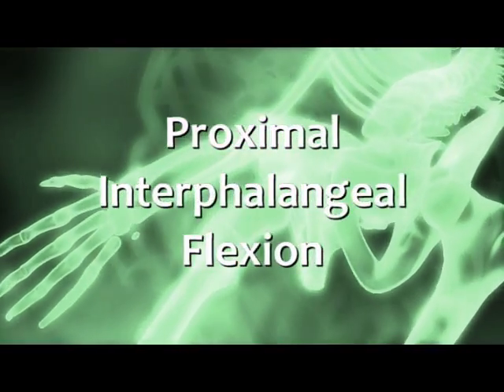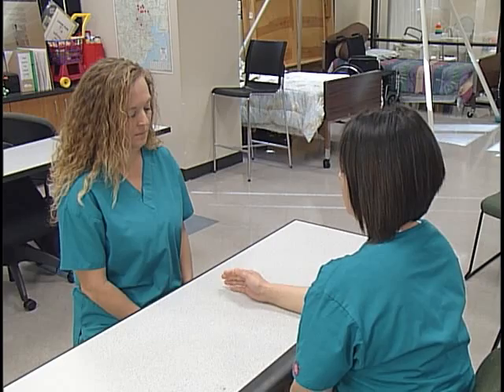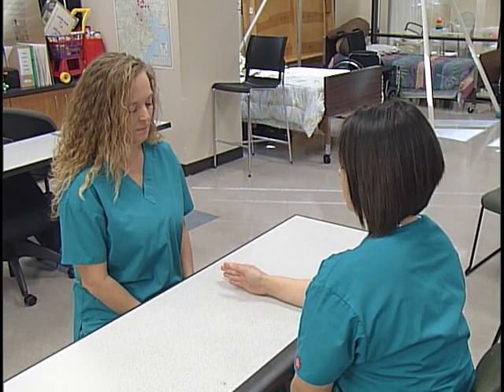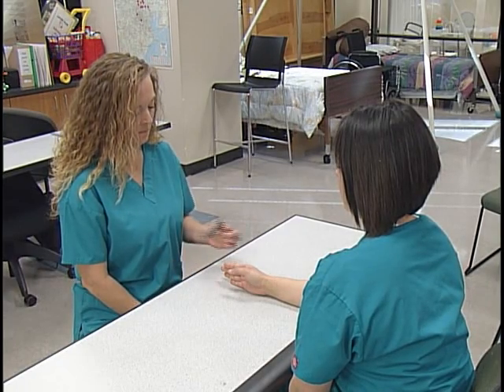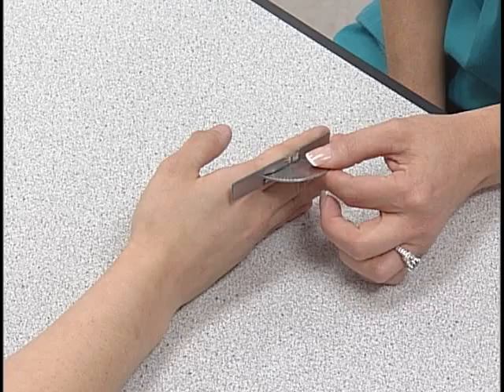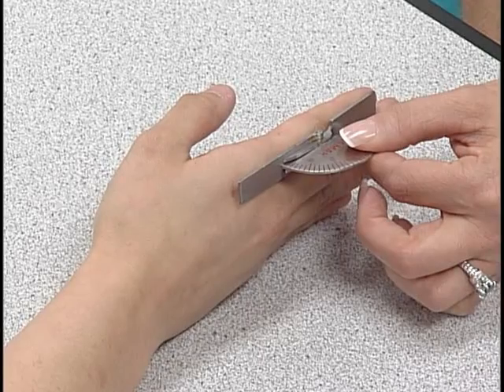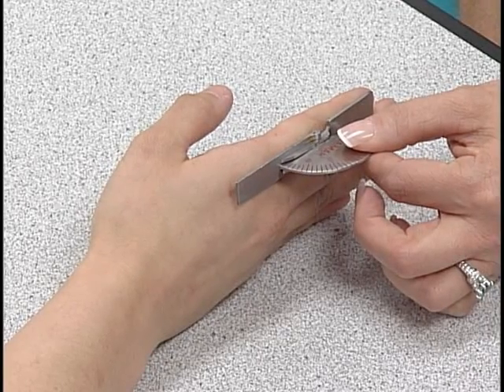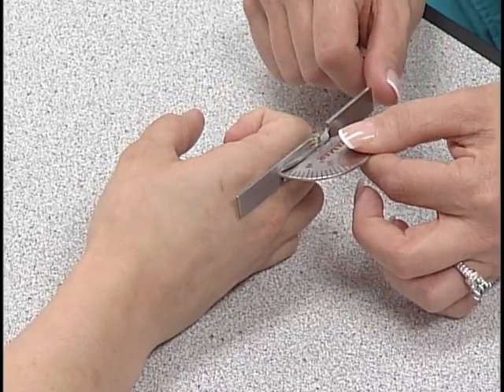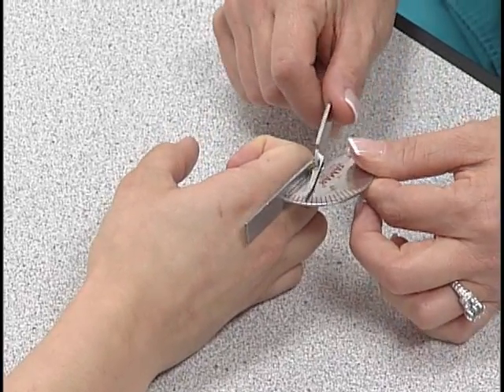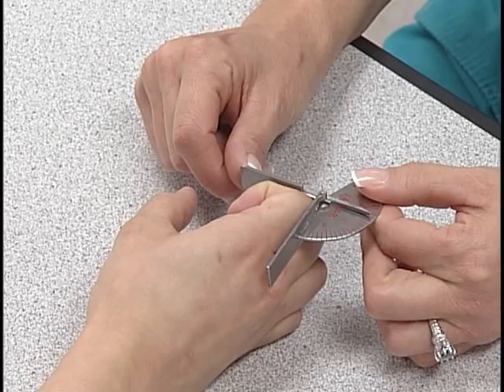For proximal interphalangeal flexion, the subject is seated with the forearm in mid position, wrist at zero degrees neutral, and the forearm and hand supported on a firm surface on the ulnar border. The axis of the goniometer is centered on the dorsal surface of the PIP joint being measured. The stationary bar is placed over the proximal phalanx and the movable bar is over the middle phalanx. The client's finger distal of the PIP joint is flexed down in a sagittal plane of movement. The measurement begins at zero degrees and can range up to 110 degrees.